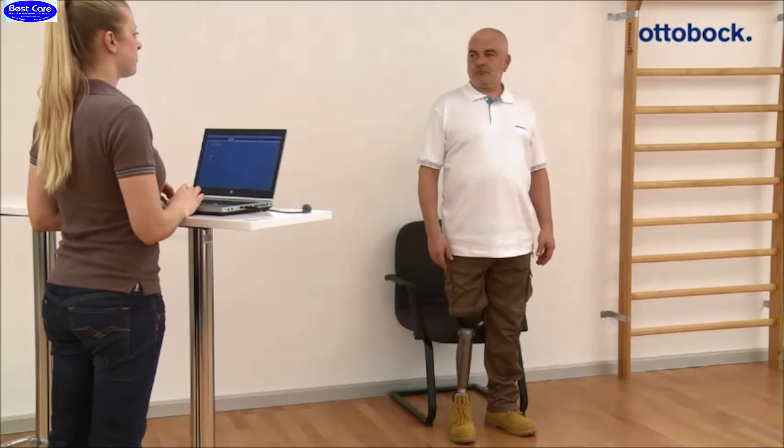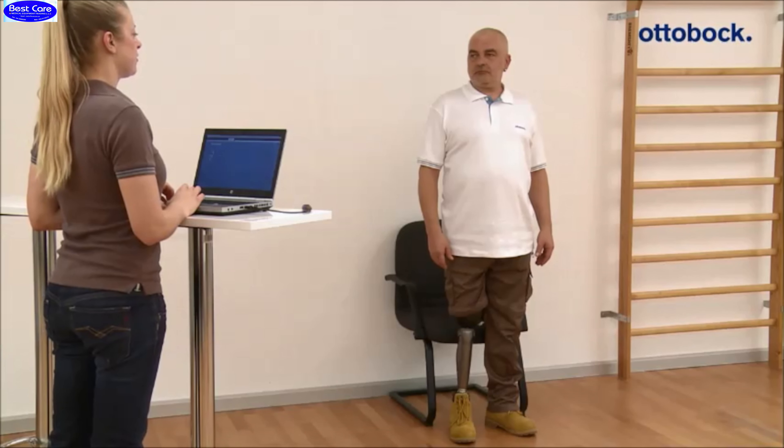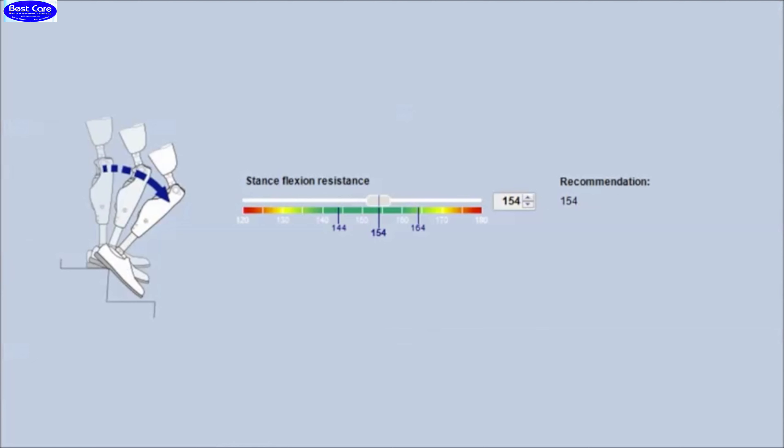The stance flexion resistance can be set up in the adjustment software for the patient individually. Based on body weight and lower leg length, a recommendation for the value is shown in the software in the field 'Recommendation'.